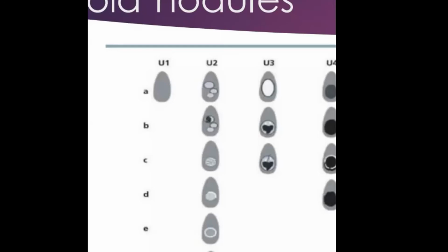The solid component is not vascularized, and the solid component is not hypoechoic than the surrounding thyroid tissue. Anything that is hypoechoic to the normal surrounding thyroid tissue will ring an alarm.